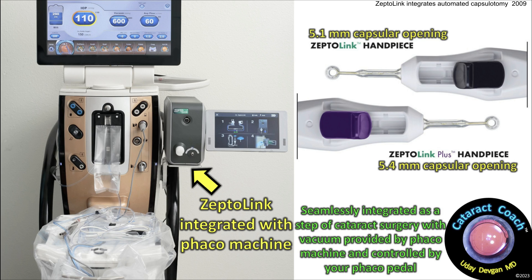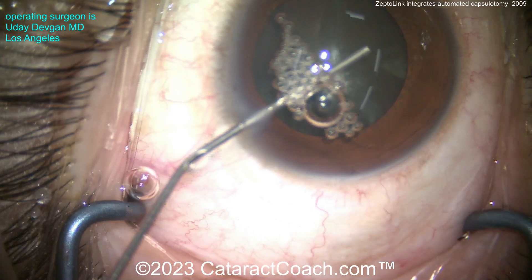Well the new device, the ZeptoLink, is now integrated with your FACO machine. It uses the vacuum of your FACO machine and your FACO foot pedal to create the suction, and then the brief four-millisecond burst of energy is delivered to make that instant capsulotomy. You can have a 5.1 millimeter diameter or 5.4 millimeter diameter, and there's no extra footprint. This machine integrates with your FACO machine.